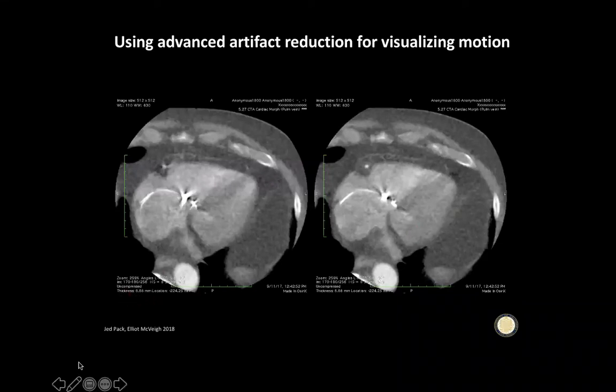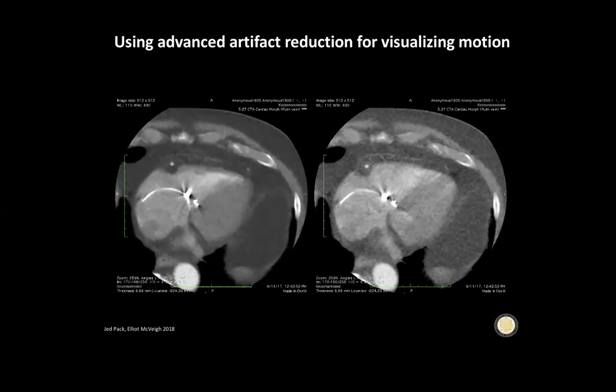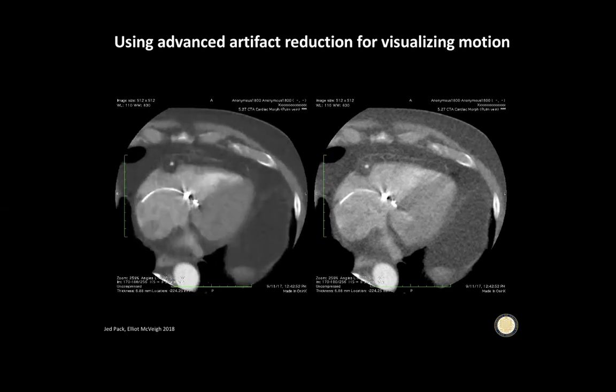Of CT data. Now, the features I want you to look at are this, which is the right coronary artery. It's basically a bright circular object, and when the patient's heart is beating, you can see that it changes its functional form or its look considerably depending on what phase of the heart cycle we're imaging it.